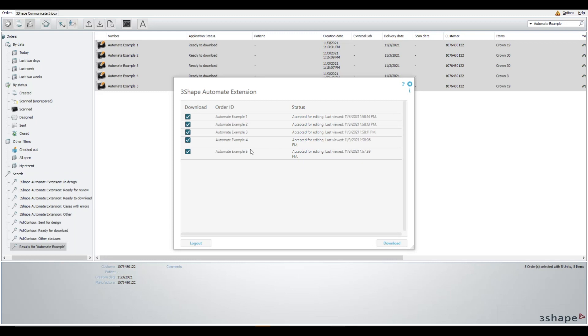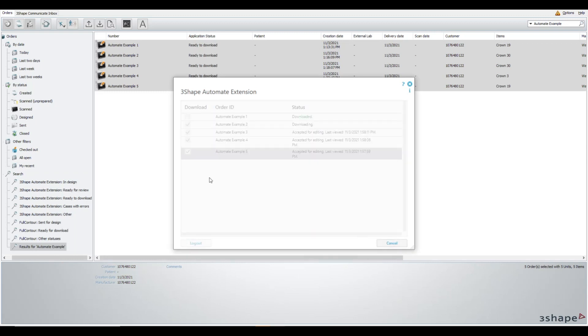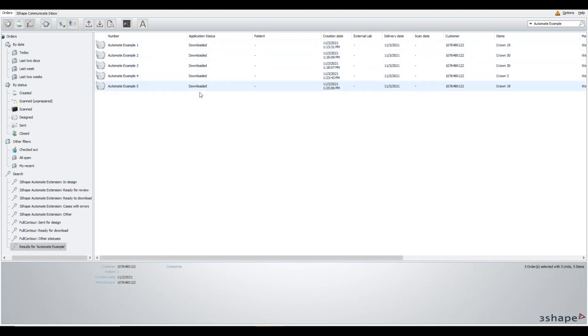You'll see them download here, which is super simple, a great and easy batch workflow for uploading, previewing, downloading inside Dental System 2021.